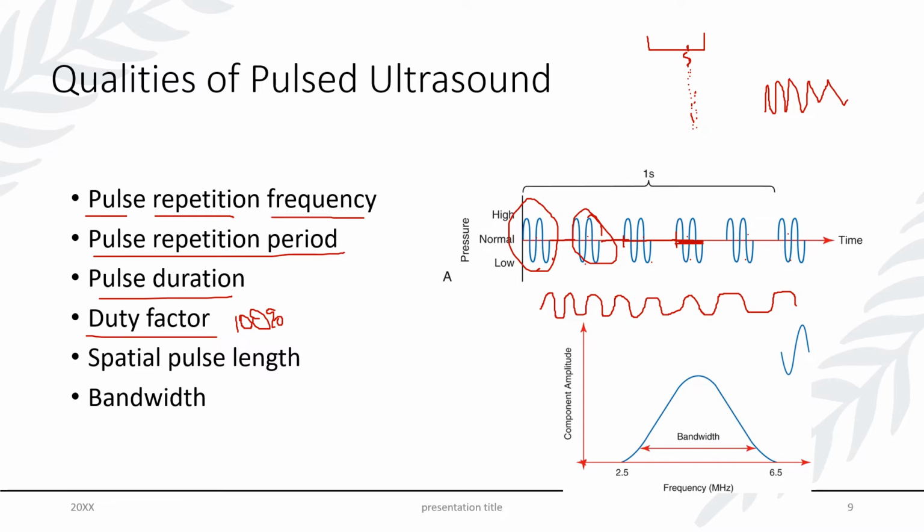50% or 0.5. Now, when we're looking at diagnostic ultrasound using principle 1, most duty factors are 0.1 to 1%, which I find very reassuring. When I'm scanning patients, I know that only about 1% of the time am I actually exposing them to any sound waves. The rest of the time is really made up by this listening period.